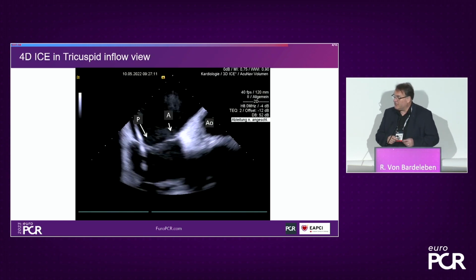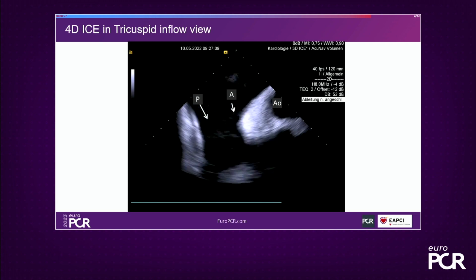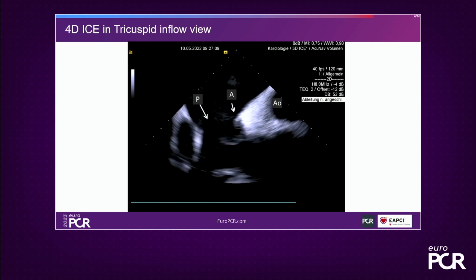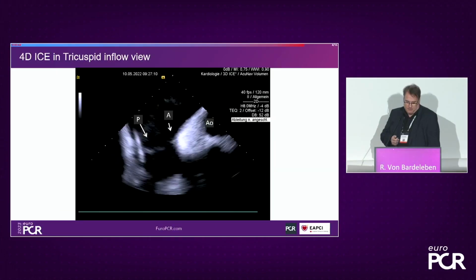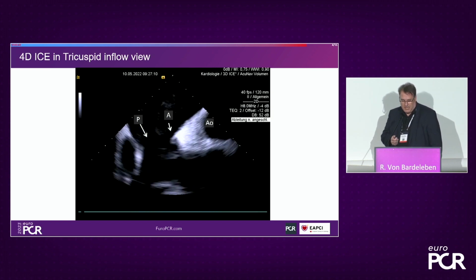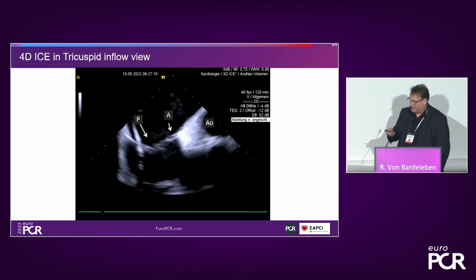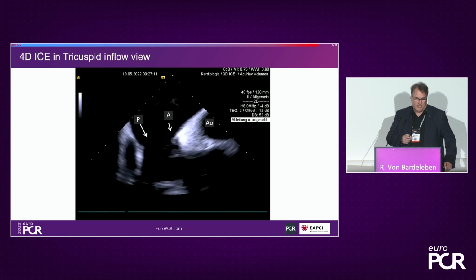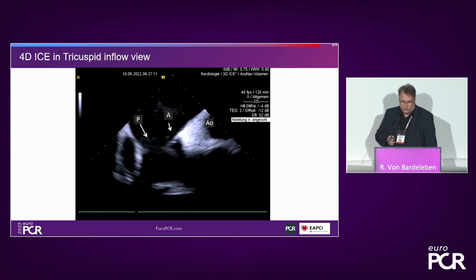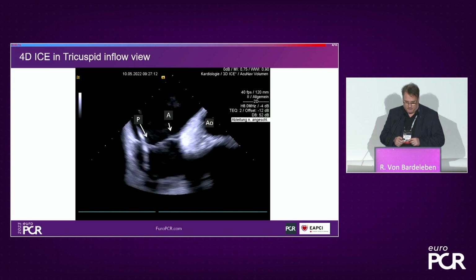So just to give you the alignment, you see this was the home view that Felix described already. And here you see one of the enemies that we have, which is a pacemaker. In real-world registries of tricuspid interventions, approximately 20 to 30% of all patients have pacemakers, which give us shadows. Also ICE probes, intracardiac probes, and we also may have ICD probes in these settings. You see that we have an excellent image, and also look at the frame rate, which we already discussed. Technically, this is 40 frames per second with a catheter that is only 11, 12 French large. You can see the aorta to the right-hand side, the anterior leaflet, the posterior leaflet, and in the commissure is actually a pacemaker probe.